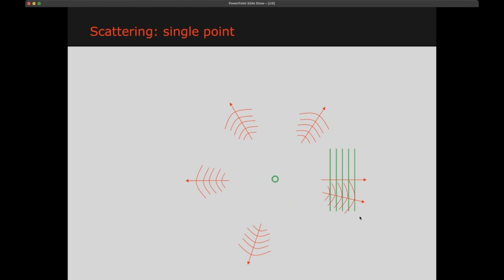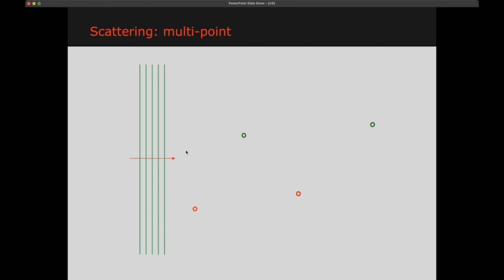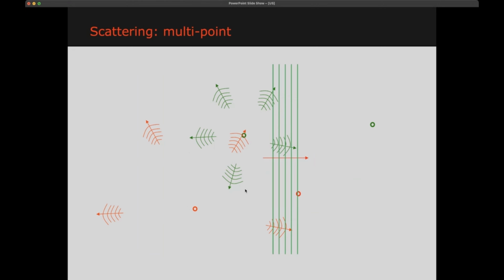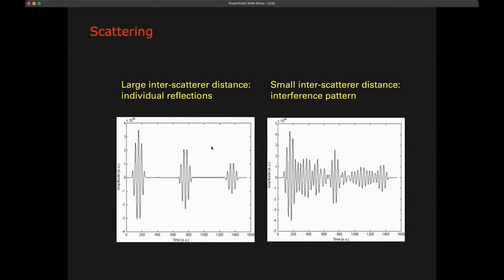So then, of course, as we said before, you keep on getting this propagation, and so you have that this is a spherical transmitter. Now, what happens if we have more objects? So we have several inhomogeneities. Of course, each of these will act as a secondary reflector, and at the moment that the wave enters there, each will actually start to emit energy back. Yeah? And if these objects are further away from each other than the pulse length, we will see them as individual reflections.